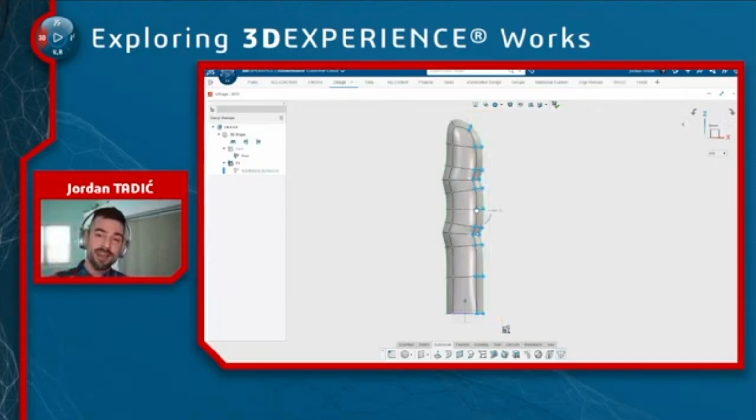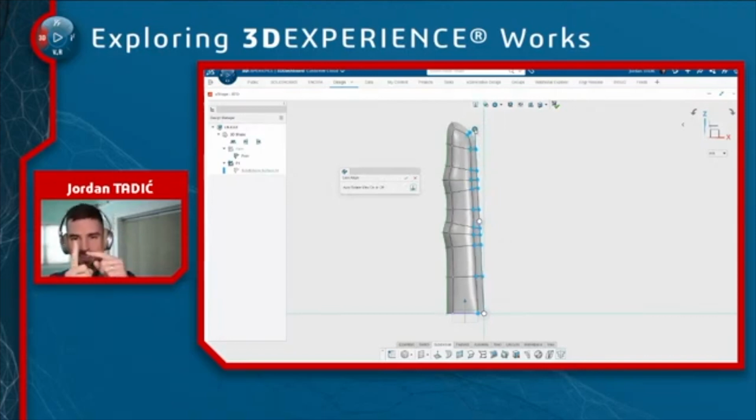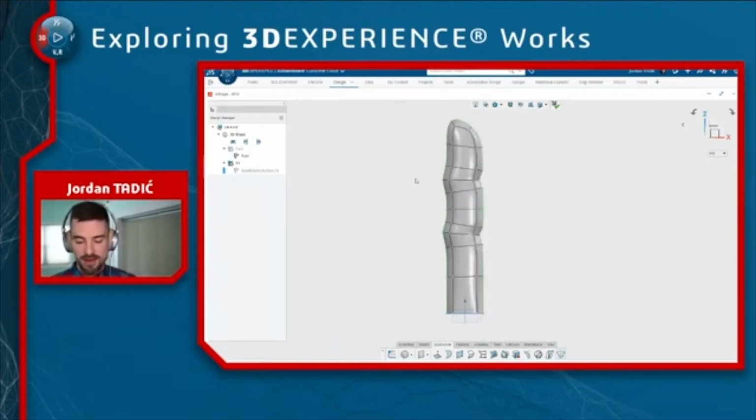So I want to do that same thing from the side view here, but that just ruined the wrinkles that I took the time to create, right? So we have to remember, though the align by line is really convenient for translating and scaling the length of things, a whole sequence of entities, it also aligns them to a line, which might not always be desirable. So what we're going to do is introduce what's called the flex tool. So let me undo that really quick.